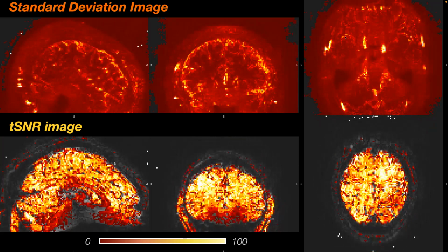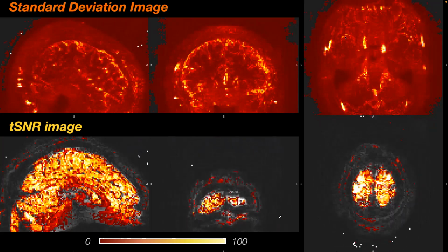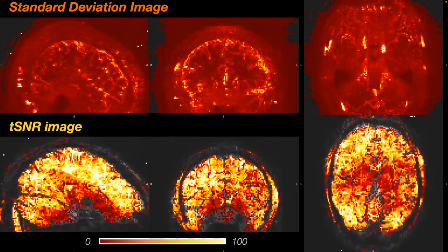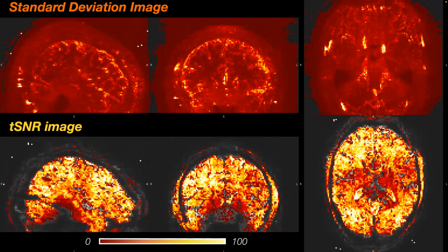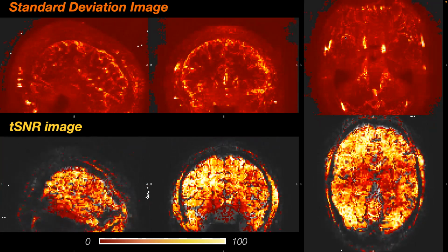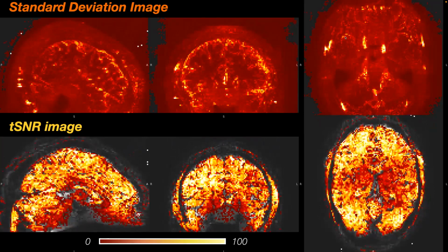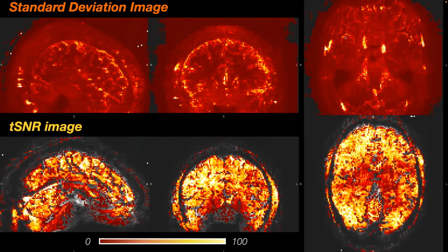Of course, there's no signal in the background, so we can really zoom into the brain. So what you see here is that we could, for example, just take all of the voxels in the frontal cortex and calculate the TSNR in the frontal cortex. And thereby we could compare across different scanners, how good is the data, right? That's really why we use this measure of TSNR. Is that clear? It's a very simple measure. And we don't even care about activations or whatever, because they're tiny compared to whatever you're seeing here.